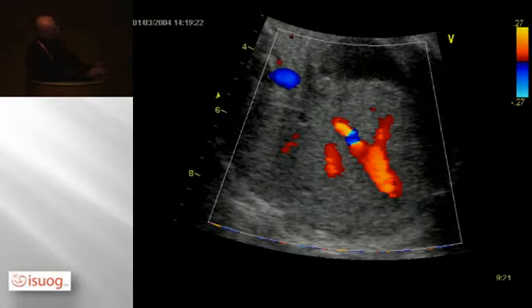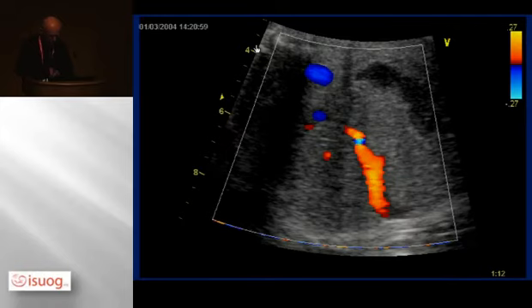But if you look at this, you'll see that if you send in the insonation angle like this, you are still at some 30-40 degrees. So you adjust this by taking your insonation a bit further to this side where the back is, and then you might get it to improve slightly. This is not a bad insonation, and you might get a really good recording.